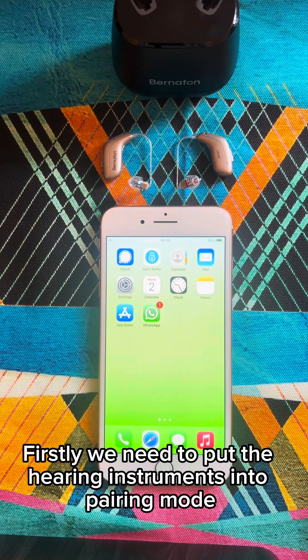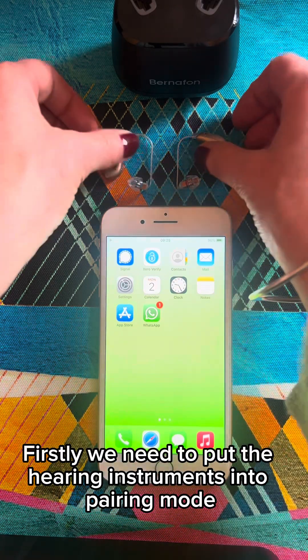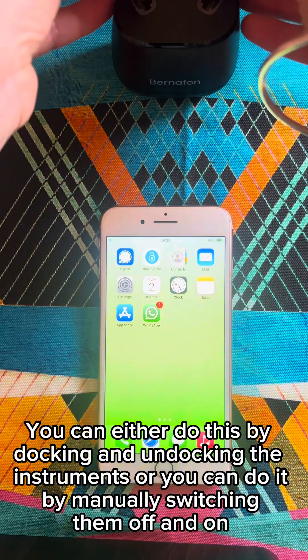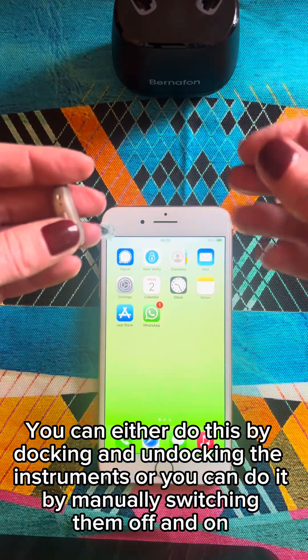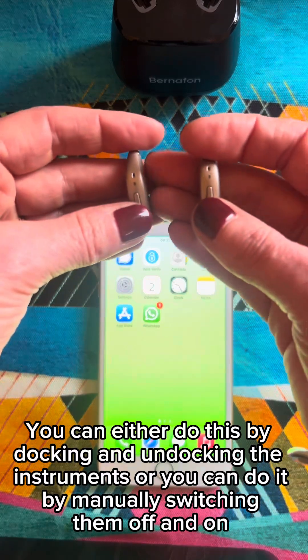Firstly, we need to put the hearing instruments into pairing mode. You can either do this by docking and undocking the instruments, or you can do it by manually switching them off and on.